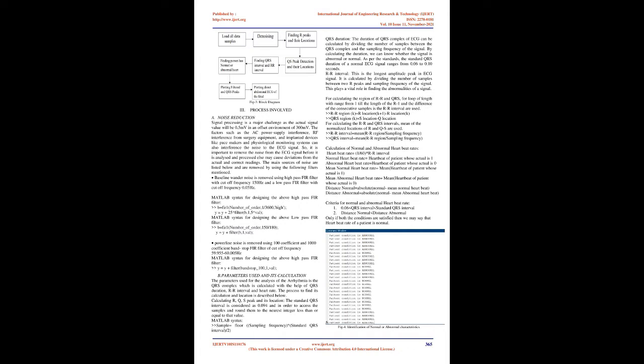ECG signal consists of a few main components such as the segments, intervals, and waves, which are studied and evaluated based on the size and duration time or interval. The heart rhythm is determined by the detection and analysis of these different components. The abnormal rhythm of the heart is called arrhythmia, or dysrhythmia, and is indicated when the above-mentioned components vary from the expected norm. Any deviation from the predefined pattern in terms of amplitude or time duration indicates an abnormality in functioning of the human heart.